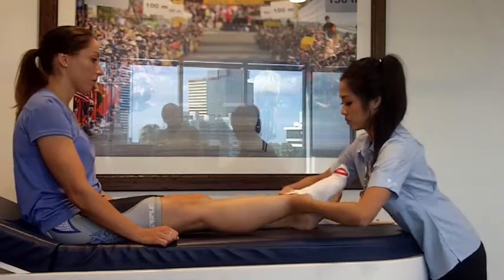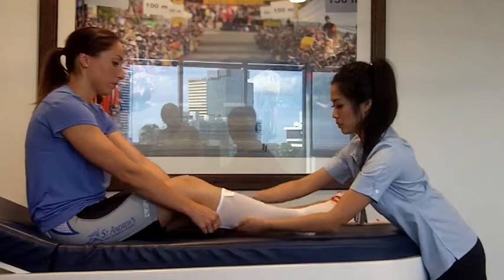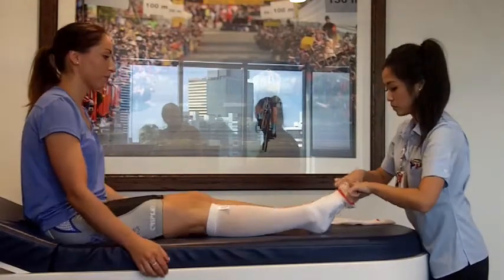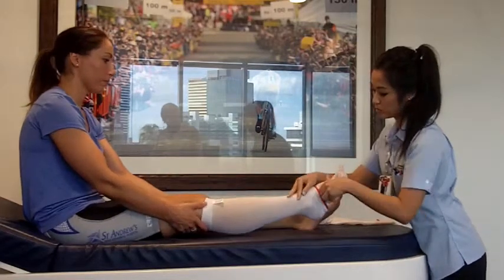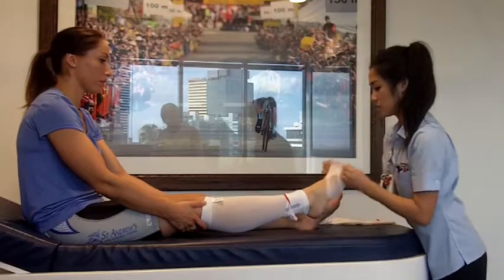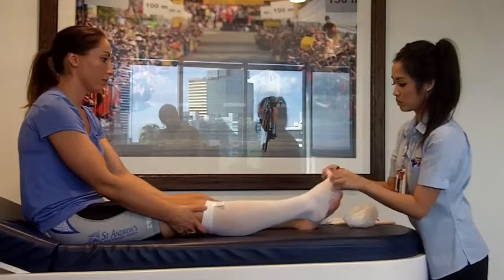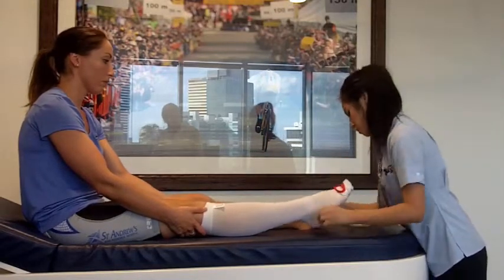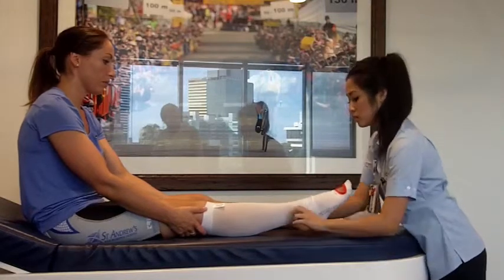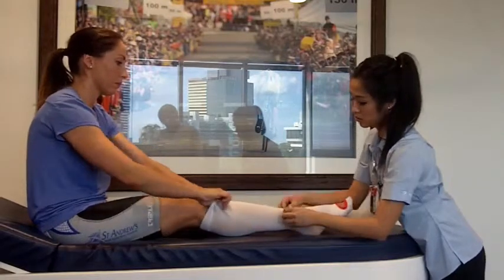Once you've got them in the right position, you just pull them up. It's important that you get no wrinkles, and it's important that your partner helps you too. Once they're in position and you've got the heel in position, you just pull them back. If you need to, just go over the ankle and then pull them down again. If this is on your affected leg, do it nice and gently, but it really is important that you don't have any wrinkles, or you can get pressure points developing behind your heel and also up behind your knees.